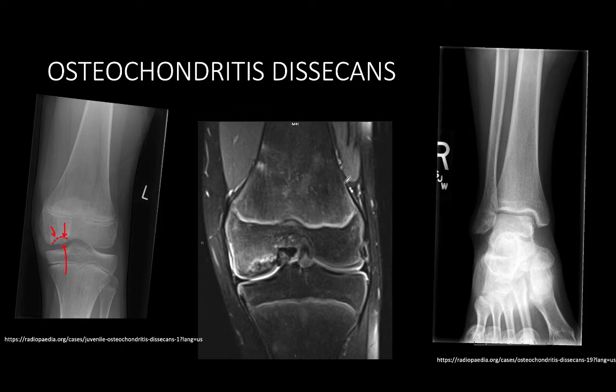Here's a cross-sectional image of the knee, coronal slice. This is some sort of fluid-weighted sequence, so a T2 weighted fat sat, or a STIR image. And you'll notice along the infero, we'll call this midline. I suspect this is the lateral aspect of the knee just based on the anatomy. But you'll note the osteochondral injury occurring in this semicircular configuration, isolating a piece of bone and cartilage that has not floated away in this case.